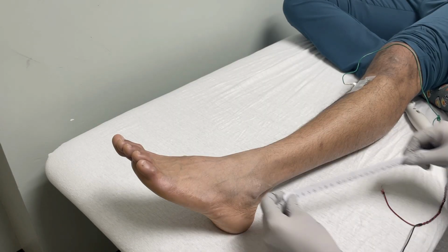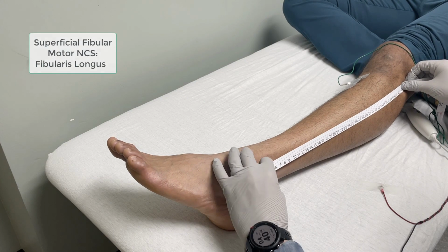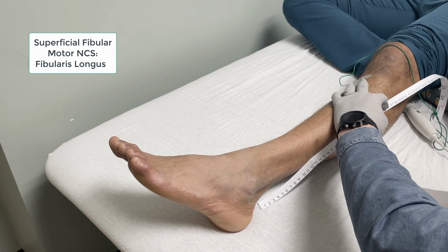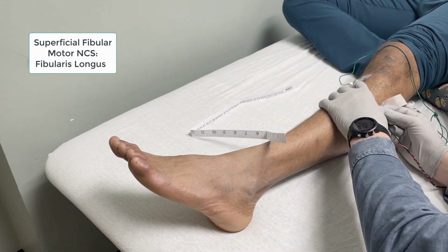The last nerve conduction study test that I'll describe today is the fibularis longus motor nerve conduction study test. The setup begins by measuring the total distance from the fibular head to the lateral malleoli. This distance is then multiplied times 2/5.